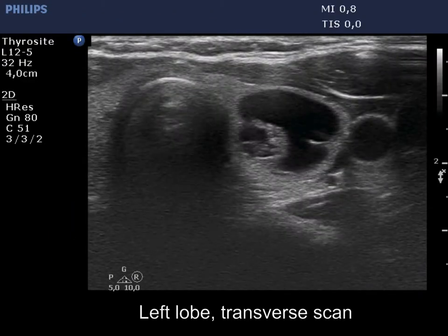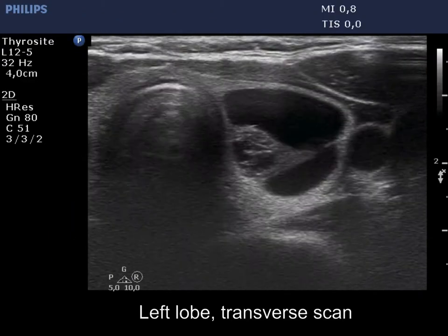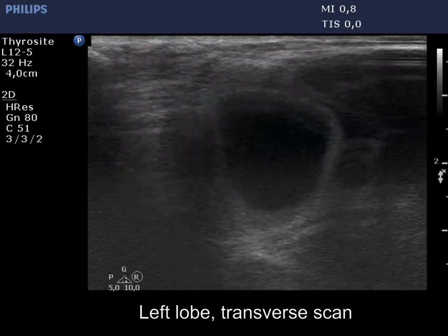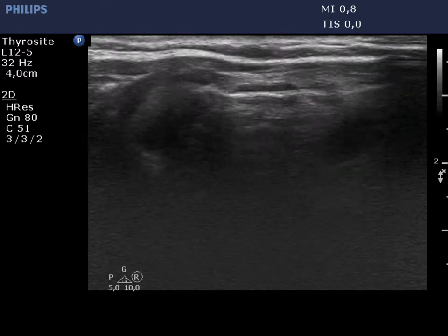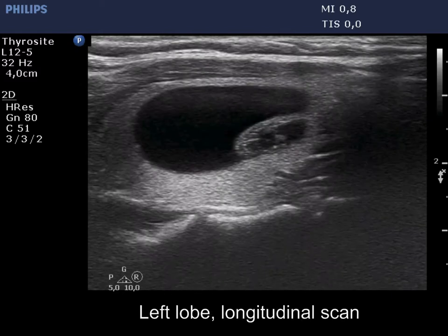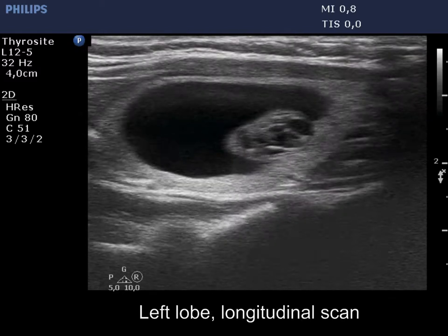The cyst has recurred. The pattern remained the same. This is a peripheral type cystic nodule.